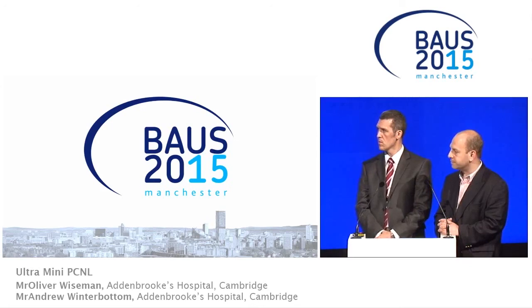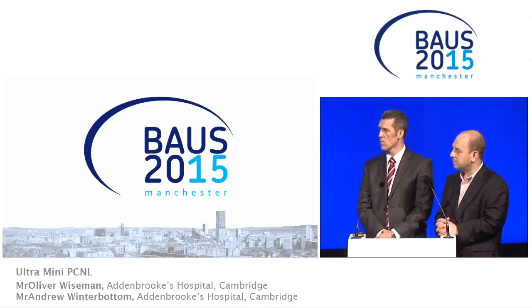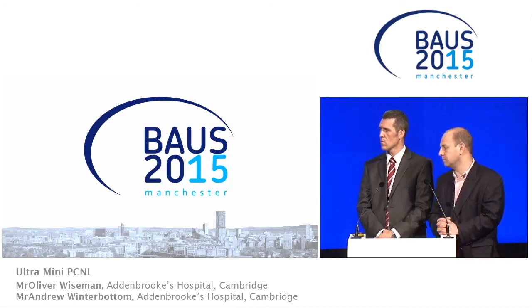Stuart? We make sure our patients have sterile urine pre-operatively. A case like this, on the background of recurrent urinary tract infections, was on prophylaxis. Our trust policy is for 120 milligrams gentamicin infusion IV during the procedure. In this lady, we upped that to a treatment dose post-operatively when she was pyrexial. Again, we make sure that the urine is sterile, but the prophylaxis is based on any sensitivities previously. If it's been sterile previously, they get gentamicin and teicoplanin, just a one-off at induction.